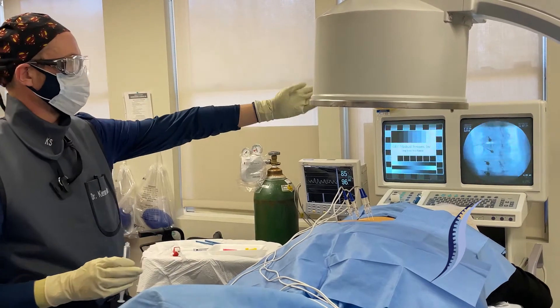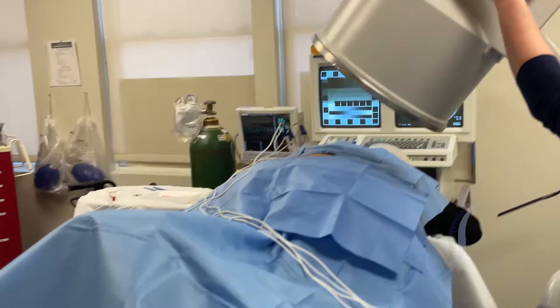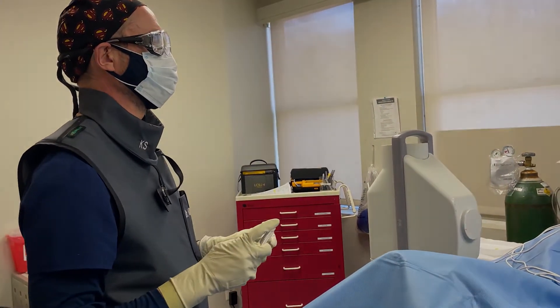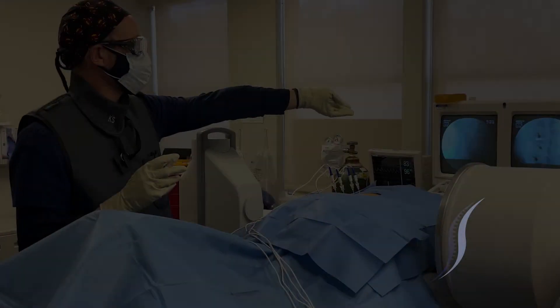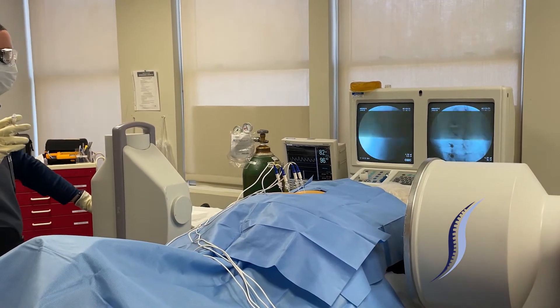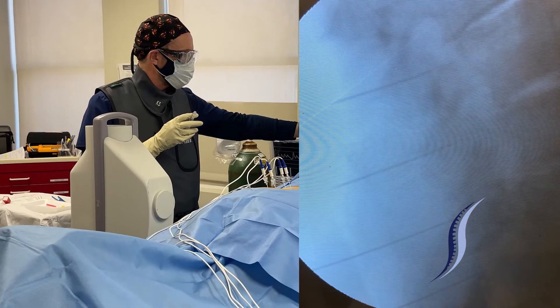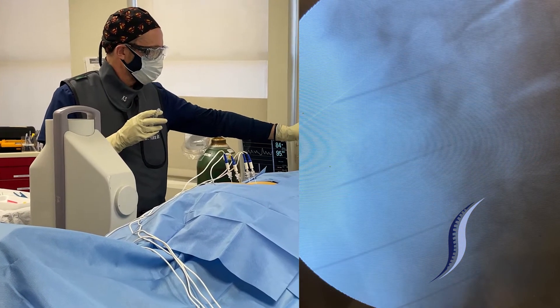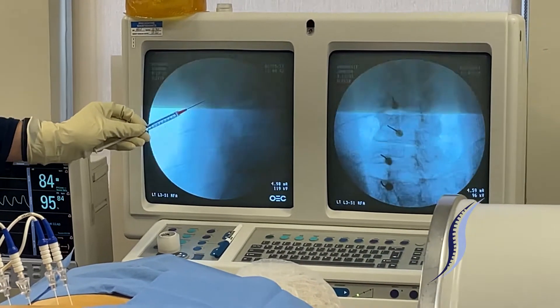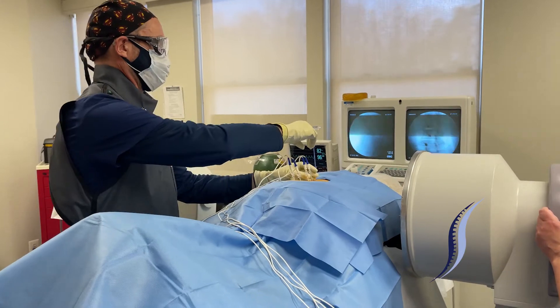What we're going to do now is take a lateral view in order to make sure that the needle tips are in the appropriate location. On this lateral image, you can see that the needle tips are coming in and touching down on the pedicles, and at no level does the needle tip advance into the neural foramen — rather, they are posterior at the level of the pedicle at each of the three upper levels. At the level of the sacrum, they are at the lowest level.